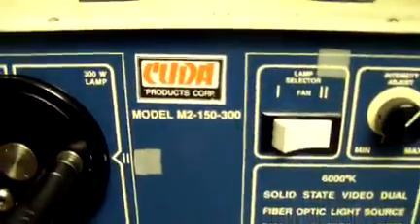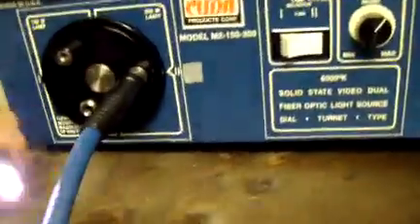If you have questions or want more info, feel free to email me through the email address below. This light source does come with the light cable.